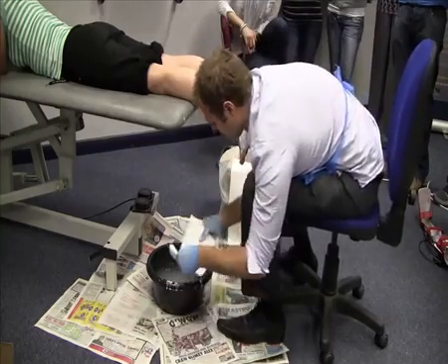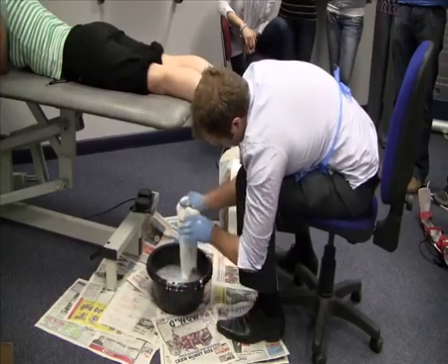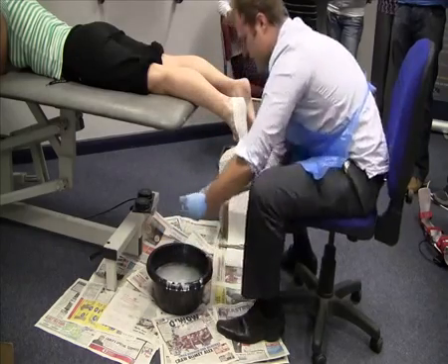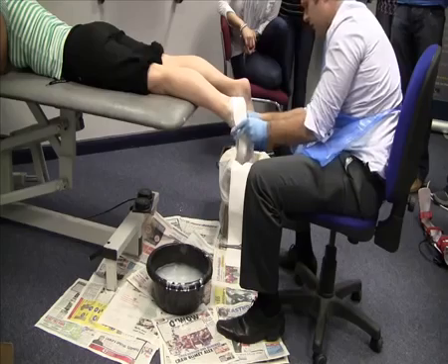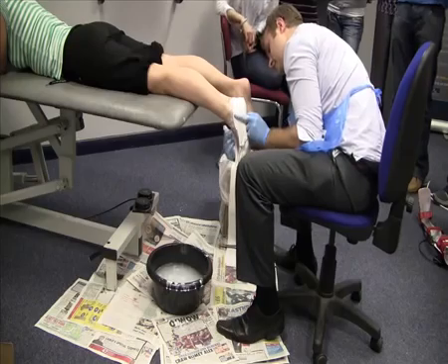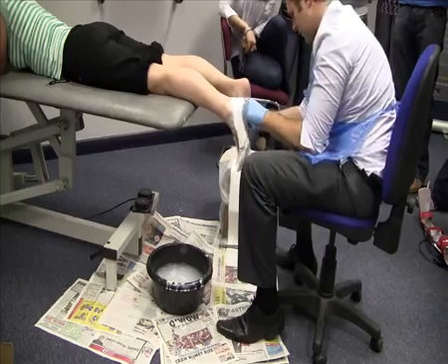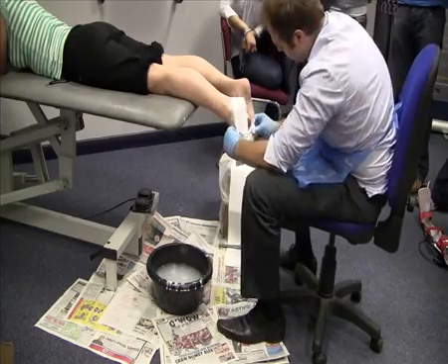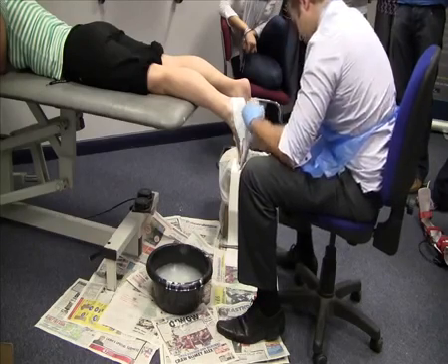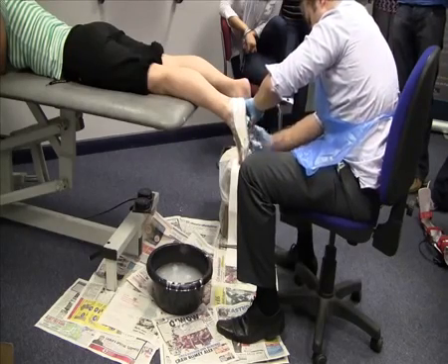Then, with the second piece, submerge again. Smooth down, fold over, and loosely drape around the base of the foot. At the connection point, just make sure you get a nice connection. Again, going with medial side and then lateral. If you have any excess material, try and get it around underneath the toes. Try not to affect that forefoot balance.